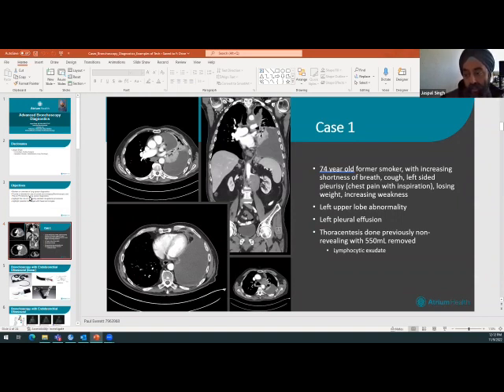So these are classic CT cuts. For those of you not looking at CT scans, there are different views that we use. Now, I'll do a couple of these. This is called the axial view. Imagine the patient's head is behind the camera. The feet are coming towards you. This is the heart and the blood vessels.